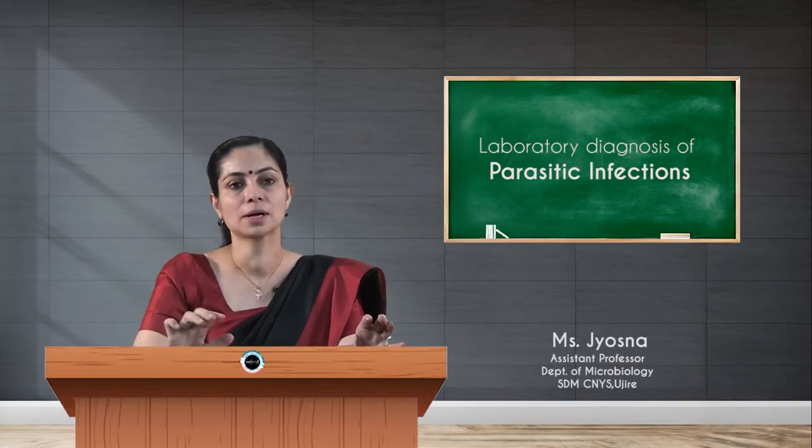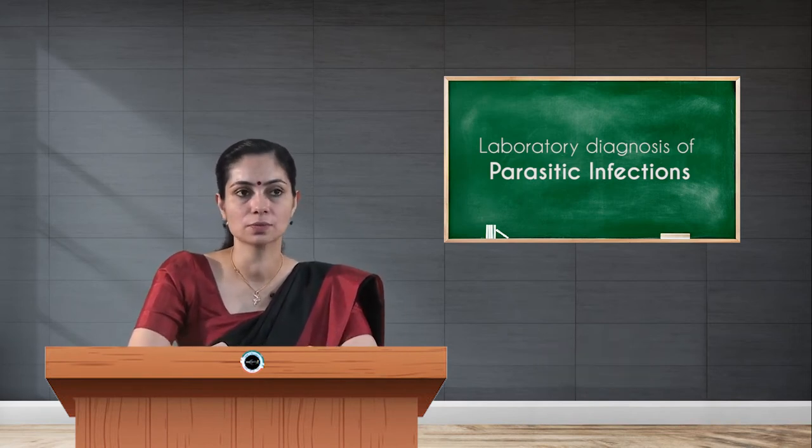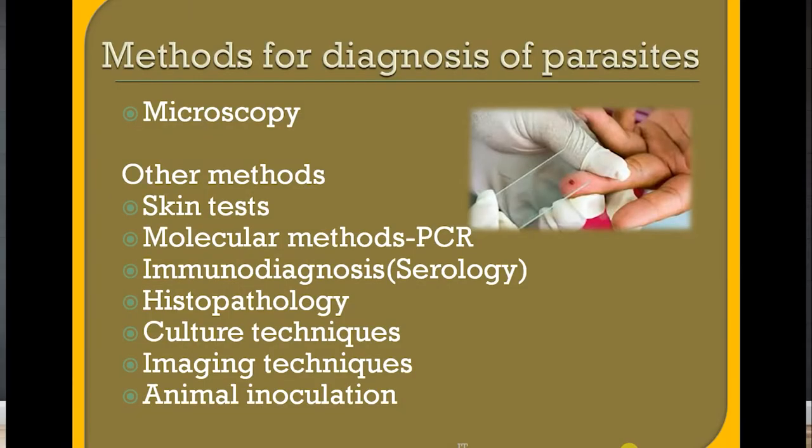I'll be doing a medical parasitology topic here, and my topic for this video is methods for the diagnosis of parasitic infection. To diagnose a parasitic infection, we have various methods available. The most important one is the microscopy technique. You collect the sample from the patient and see the sample under a microscope. That will help you to diagnose or get an idea about which parasitic infection it is.